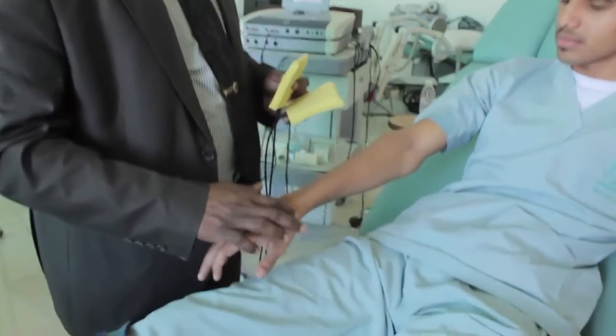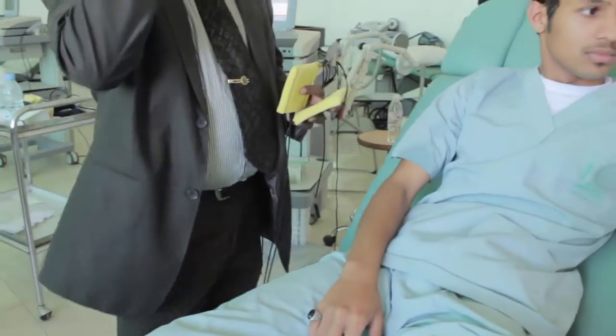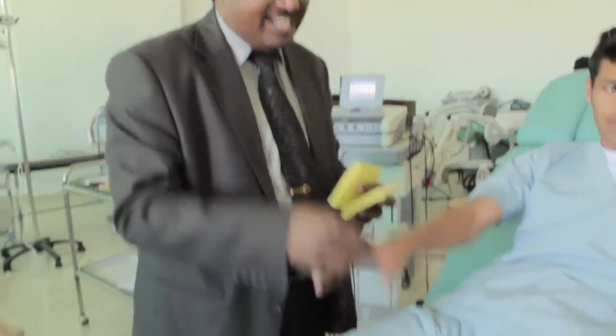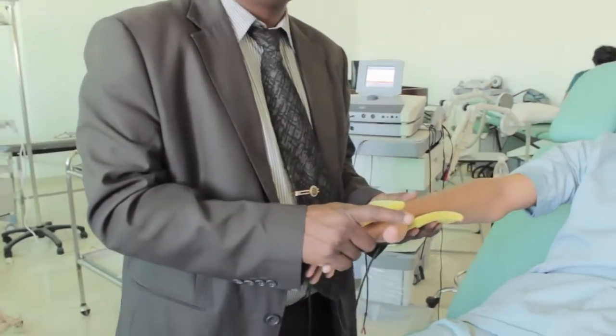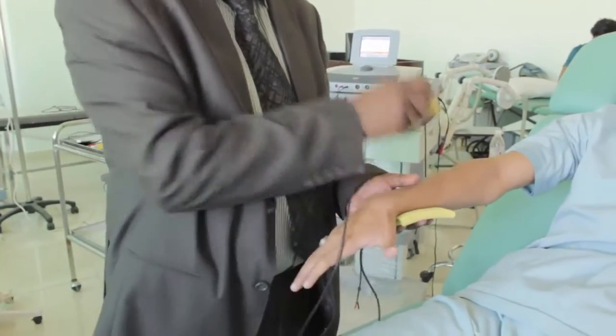Understood? Yes. Okay. So this is for De Quervain's disease, the inflammation of the tendons. That means when we put cathode here and anode here, it's wrong. It is wrong. Okay? But in some cases like Faradic current, you can use, no problem. Or if it is too narrow, like a thin hand like this, then you better keep one here, one here. Okay, of different channel, you can keep one here and another one here.